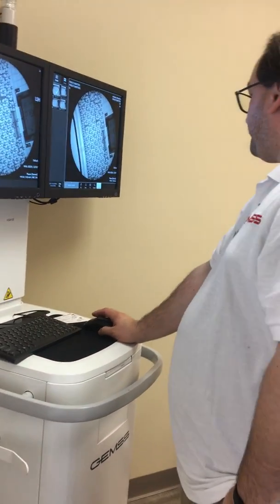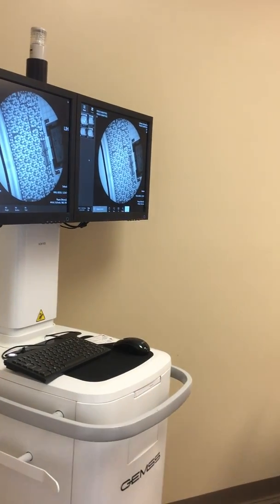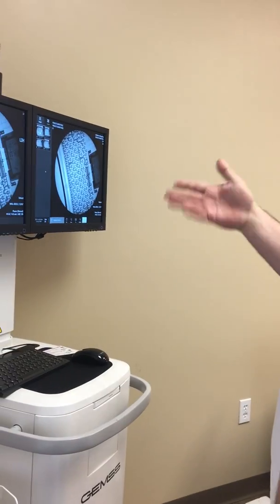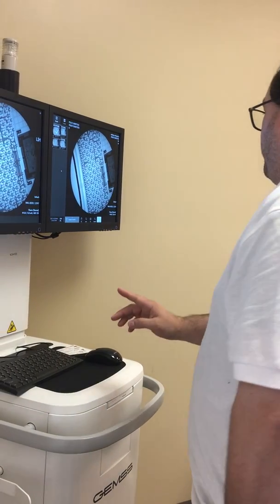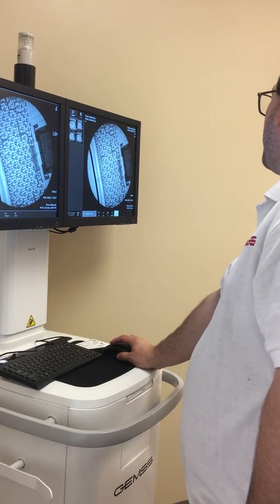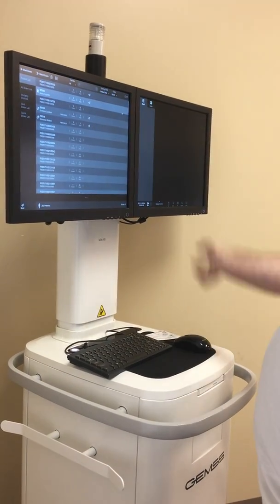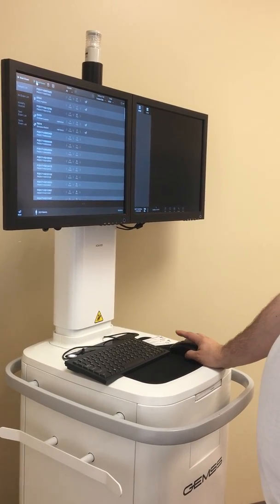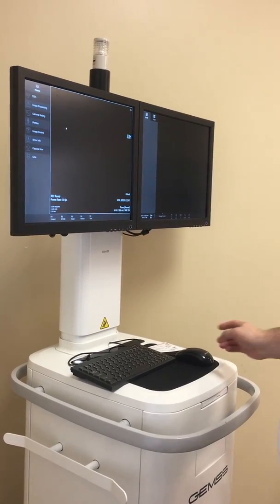So, okay. The reality is this is only 2 minutes after we started and all the other stuff never happened. So we came in, we acquired an image, procedure's done, everything's great. We need to move on to the next patient. So you have this little back arrow here. Okay, you click that, it takes you back to the database. Your next patient comes in, you hit quick exam. There's your next exam. Okay.